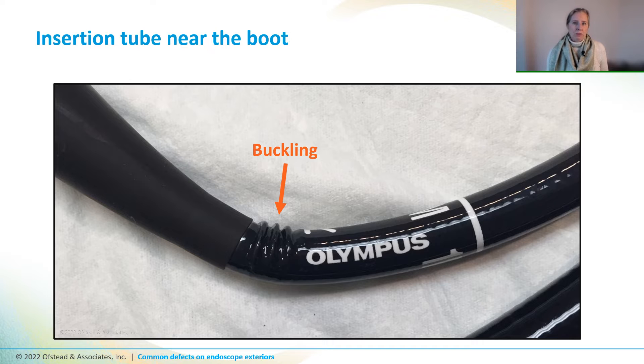Now let's take a look at some defects. This scope has buckling on the insertion tube right next to the boot junction where it connects to the control body. This defect is important because the scope can bend sharply and that could pinch fragile components that are inside there.